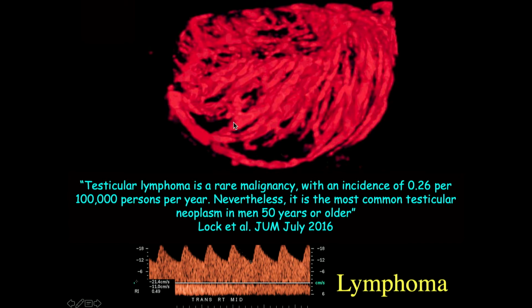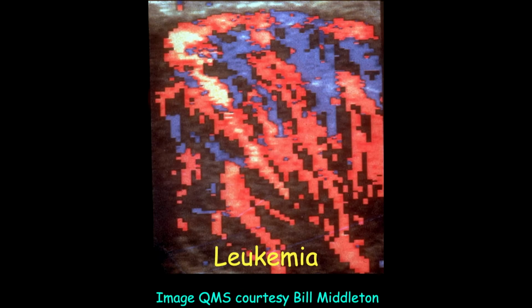So in another setting, if this guy was a sailor on shore leave and had fever and discharge and all that, you'd say this is an epididymitis. But the beauty of ultrasound is you get to talk to the patient, and when he gives you no leading infectious histories but says, yeah, I finished my chemotherapy 6 weeks ago, you're going to worry about lymphoma.